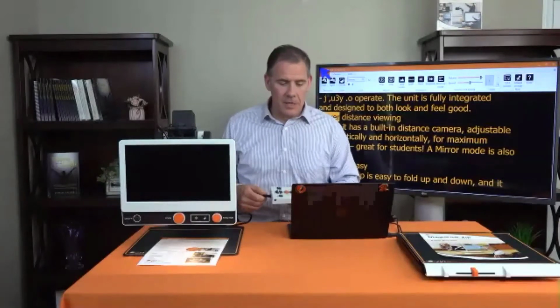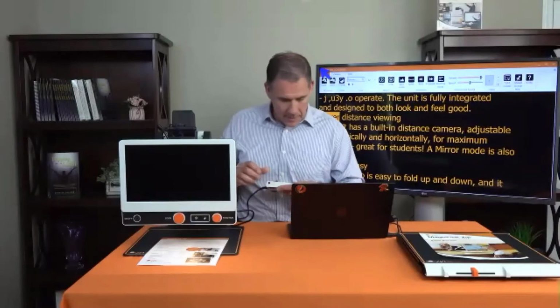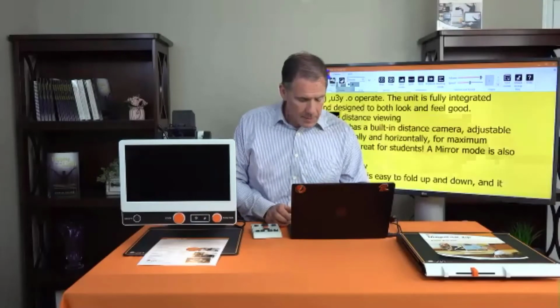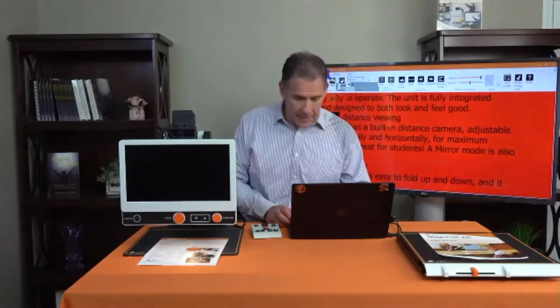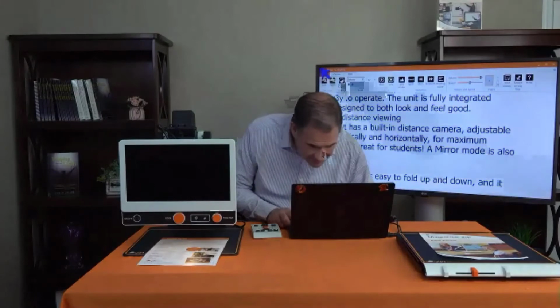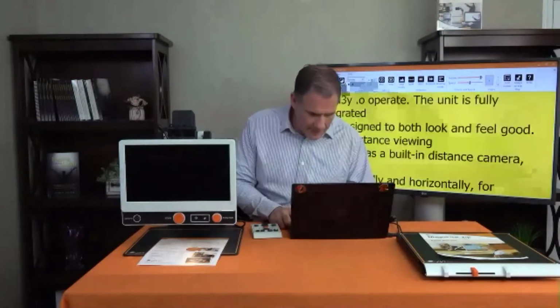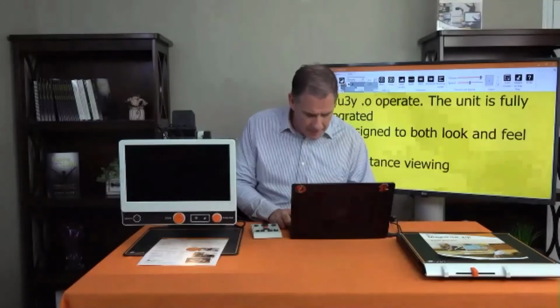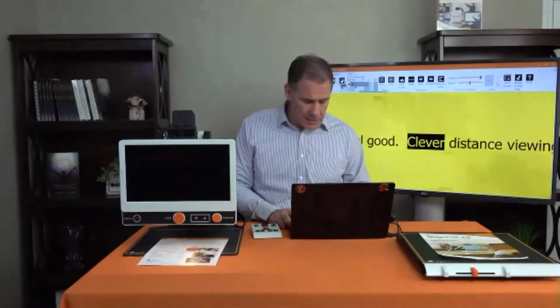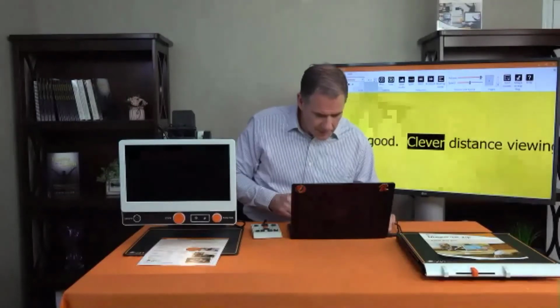So I can now change with my device here. I'm sorry, I'm in OCR, so I need to go do. So I can choose. I can magnify this. If I wanted to make this larger, I don't know about that color. We'll just pretend I like this one. Now I can enlarge it. Now I can jump over to the letter B, and I can change the view of it. I'm going to go to color so you can see, if you don't mind.